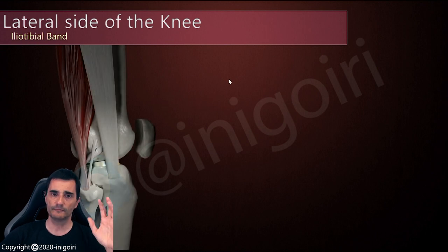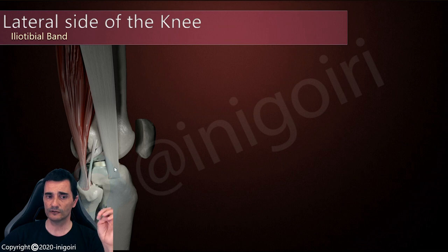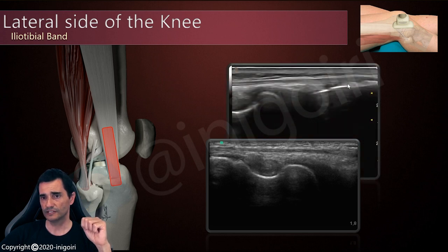Another structure is the iliotibial band. As you know, its origin is in the iliac crest, and it goes down all over the lateral side of the thigh, and its insertion is in the tibia, at the Gerdy's tubercle on the anterior lateral side of the tibia. To locate this structure, note that it is anterior with respect to the lateral collateral ligament and the biceps femoris. So if we place the probe following the direction of the thigh and reach the joint line, we find above the popliteal tendon this thin fibrous structure, which is the iliotibial band. If we follow this structure, we will notice its insertion in the Gerdy's tubercle. It's easy to find once we know it's slightly anterior, because it's very wide and quite superficial.